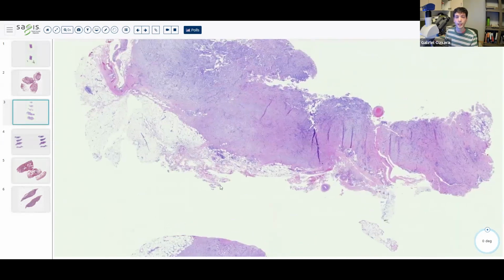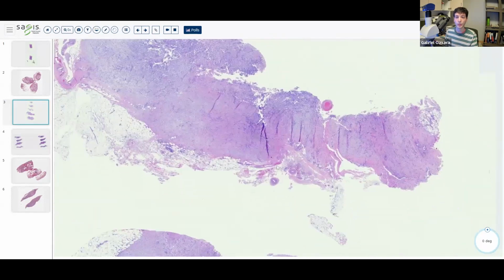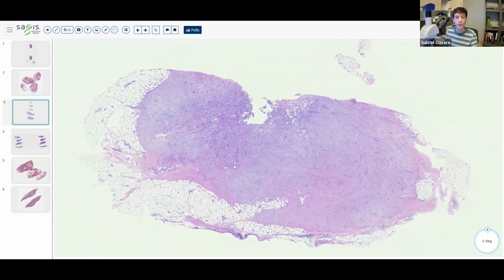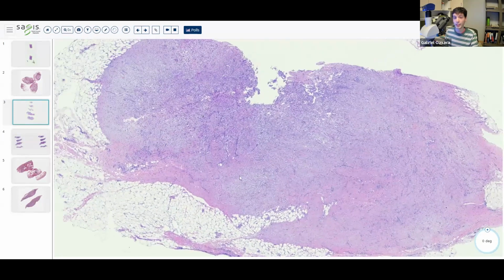proliferation. And something that's important to note, especially when dealing with soft tissue lesions, is to not immediately categorize something as quote unquote invasive. There are soft tissue lesions that are infiltrative, but still benign. So that's why that word infiltrative is kind of used as like a, hey, that looks like it's a little bit worrisome, but hey, it's not actually invasive. So it's kind of a good descriptive word to use, especially when you're unsure if something is overtly malignant or potentially benign.